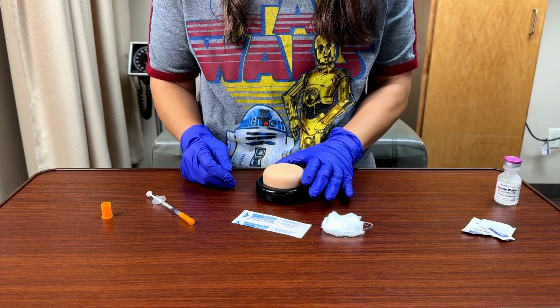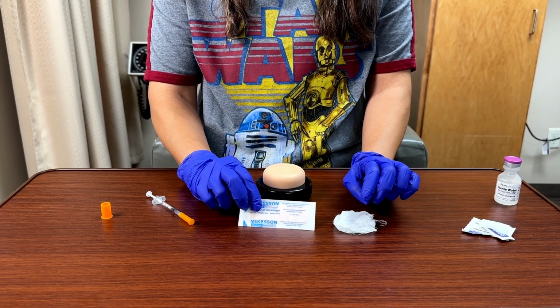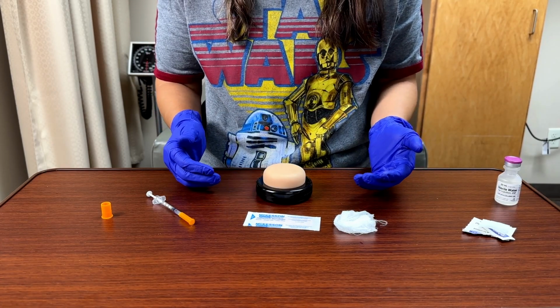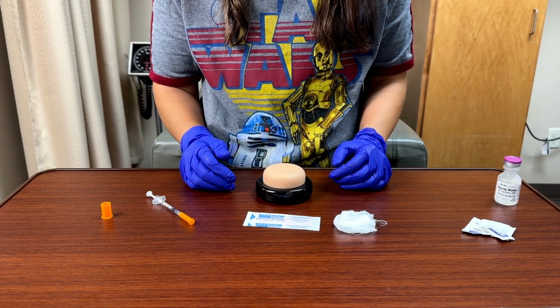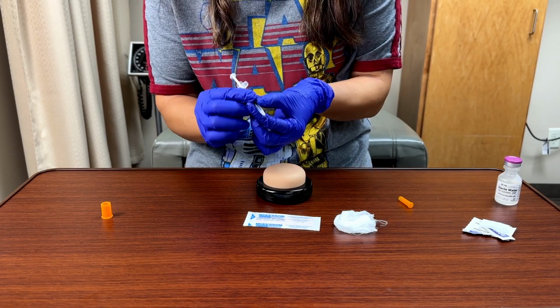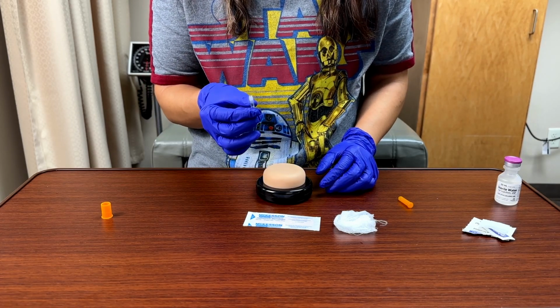And with a subcutaneous injection, you don't always need a Band-Aid or a cotton swab because a lot of times these do not bleed and you can just leave them. Most patients that self-administer insulin or other things, they don't put a Band-Aid on it when they're done. But for our rubric, it is included, so I will walk you through that as well. Now, the way that we hold an insulin or subcutaneous injection is going to be a little different. For the intramuscular, we did a dart because we were going in at 90 degrees. For a subcutaneous, we're going to be going in at 45 degrees, okay?